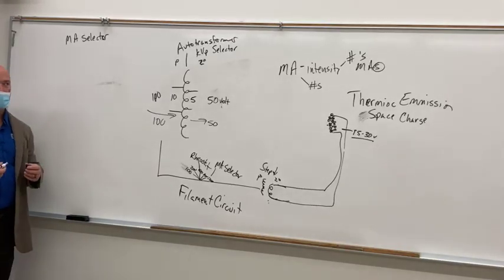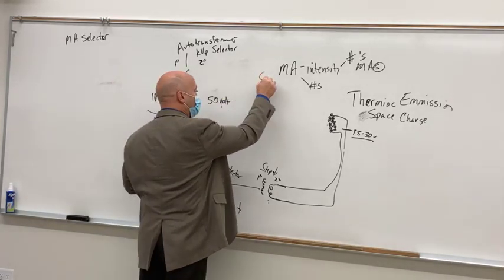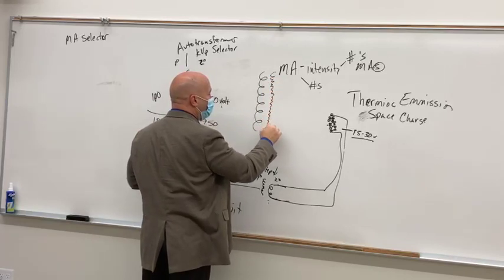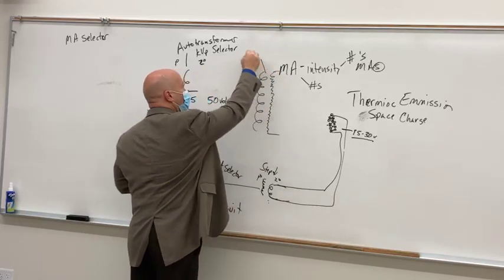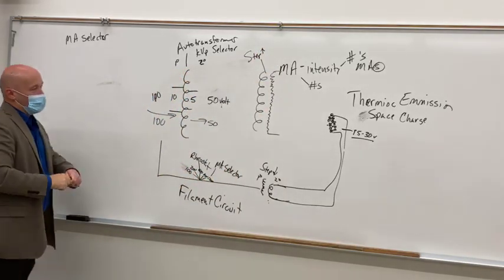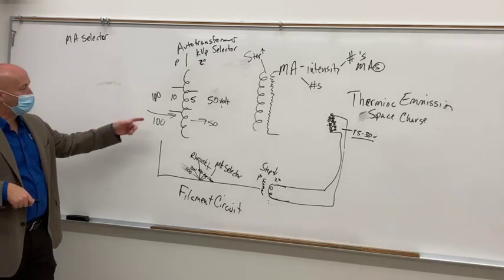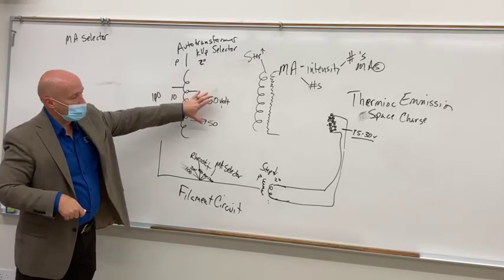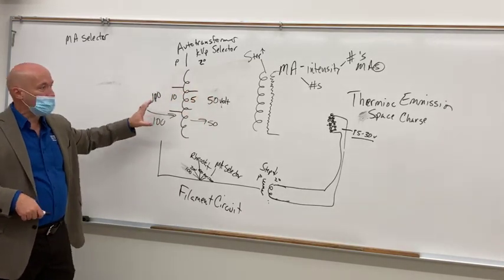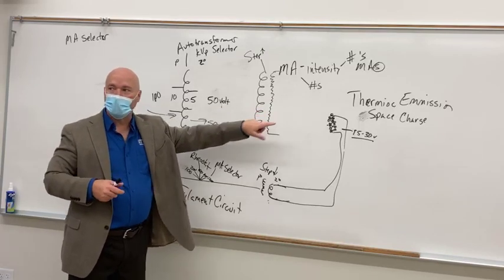So why do we call it kVp? We'll call it kVp because after it comes out of that, what's it going to go into? Step-up transformer. So how did this thing work? You could turn it up, turn it down, right? You could have more turns on the secondary side than on the primary side. You could have fewer turns on the secondary side than on the primary side. Can you do that over here? No, it's always going to be the same.